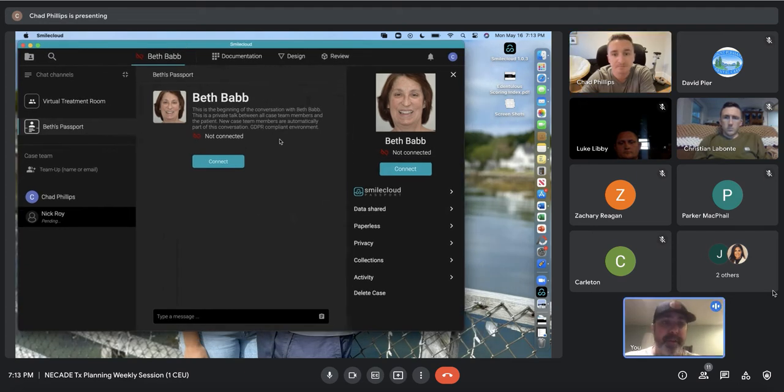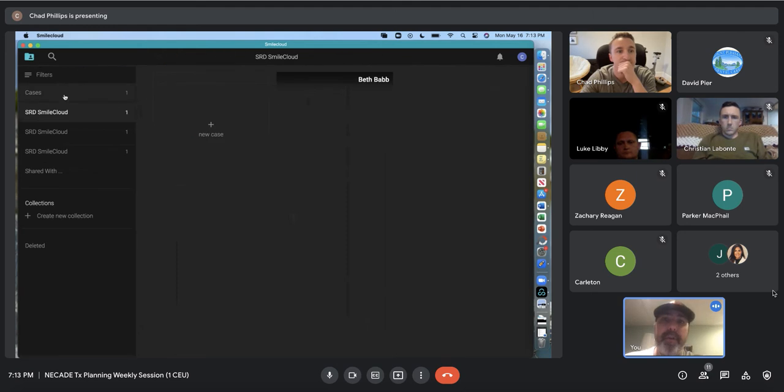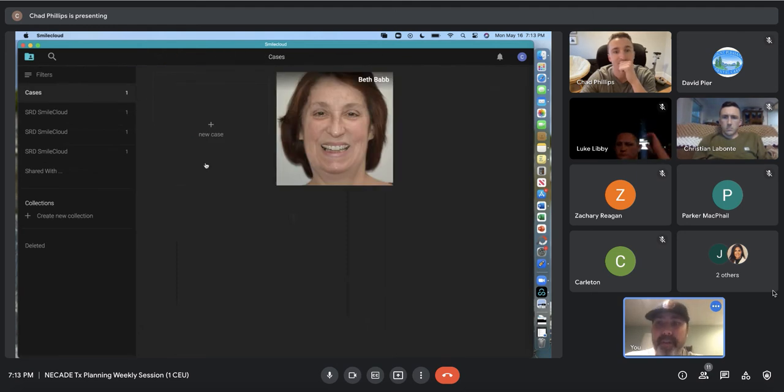Before you go on, Chad, for the others that are newer here, our goal with this group is efficient, comprehensive, and thorough treatment planning. Any tool that you come across that might help us in this endeavor, we're always open to sharing. I do think that this particular program is probably the first thing of its kind. We kind of have something like this. It's a makeshift potpourri of different products where I think this brings a lot of things together.